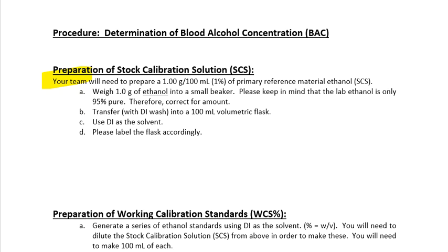So you will be sharing data, sharing in the sample prep, and sharing in the data analysis, but you will be turning in your own data sheet with your own questions answered, all right? I don't want one sheet to represent all 3 people of the group. I want you to work together to process the samples in the lab, but after that, then it's over.